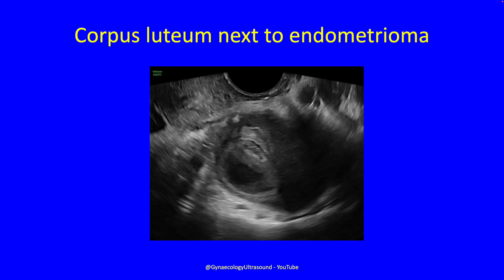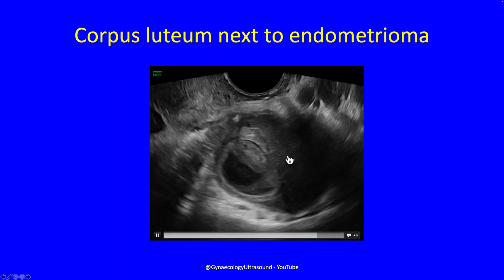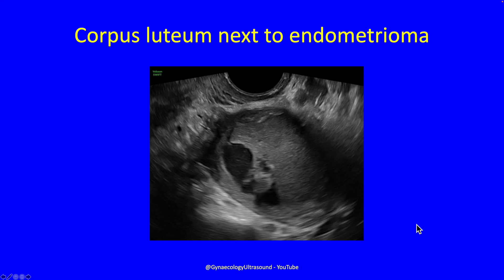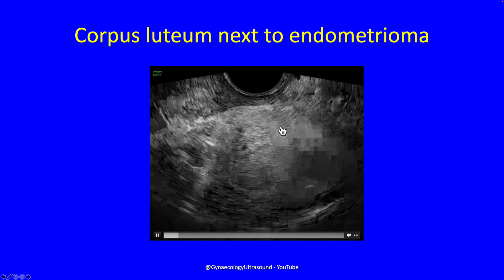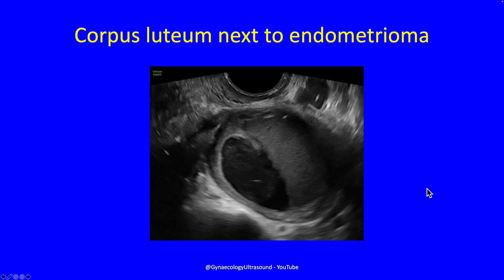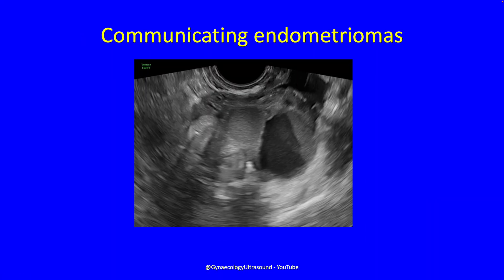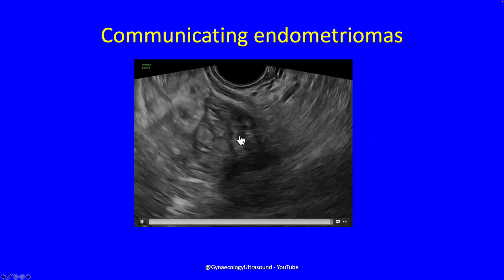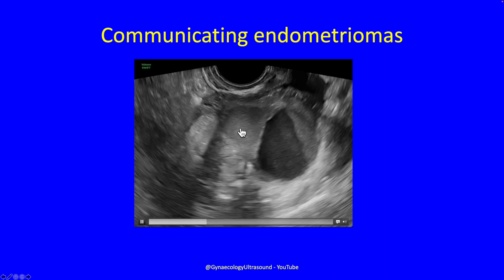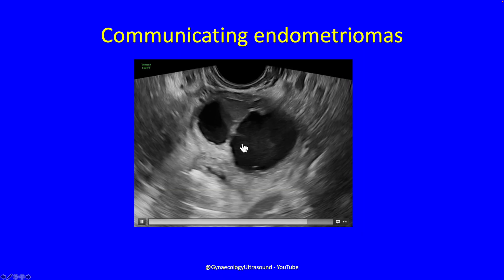Sometimes you see a corpus luteum right next to an endometrioma. This is the corpus luteum and this is the endometrioma. You can see it's slightly thick-walled and it would be vascular at the periphery with color Doppler, and there's some clot sediment in there, whereas this is the more typical ovarian endometrioma. Sometimes endometriomas communicate with each other — a fresher haemorrhagic cyst has ruptured into this more established endometrioma, as you can just see here.